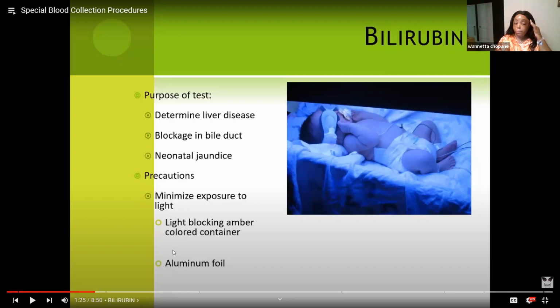Once you draw it, okay? Back in the day, they used to use foil paper, because foil paper obviously protects it from light and everything else. If you get hired at a small functioning lab, y'all probably like, ooh, we still do it back in the Stone Age. We still use foil paper to cover up. I don't know, you may work somewhere like that.